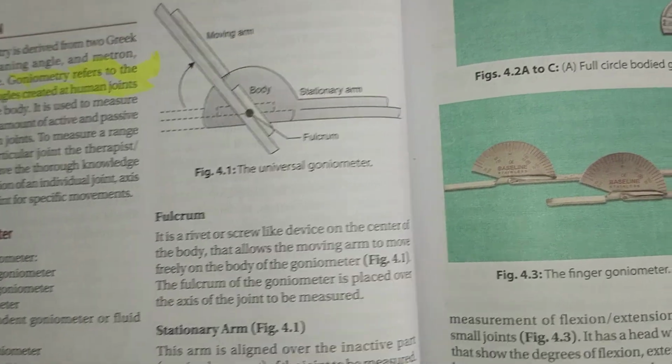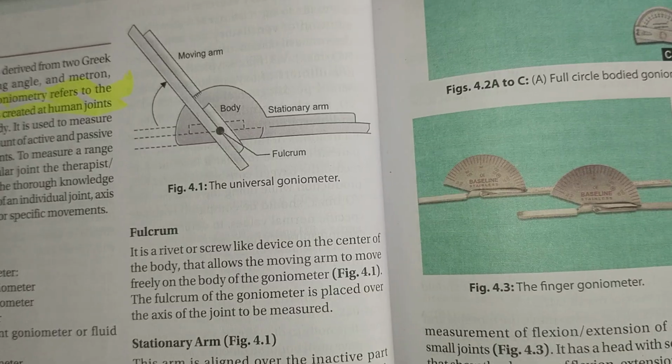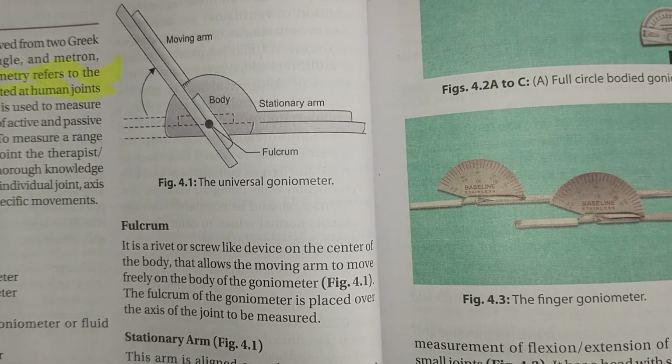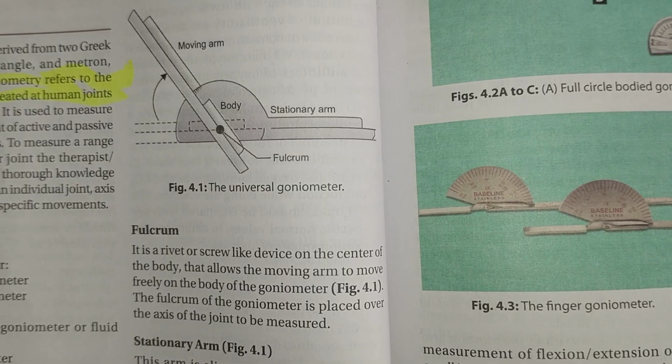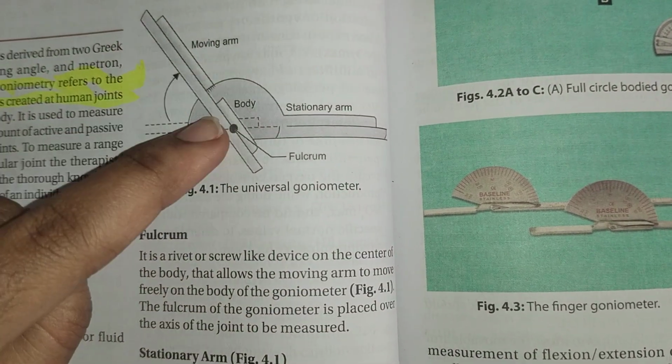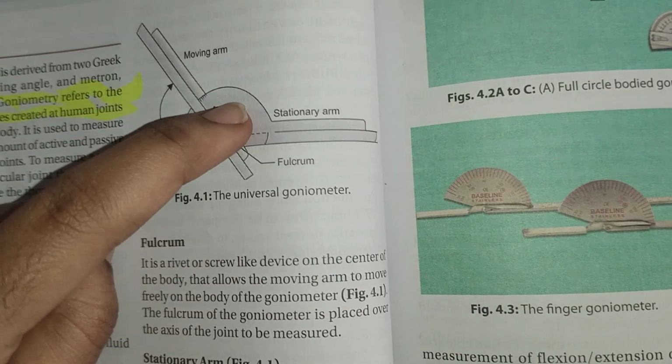And the next one, fulcrum. It is a rivet or screw-like device on the center of the body that allows the moving arm to move freely on the body of the goniometer. What is the fulcrum? This is the fulcrum. It is a rivet. It is a screw-like device.